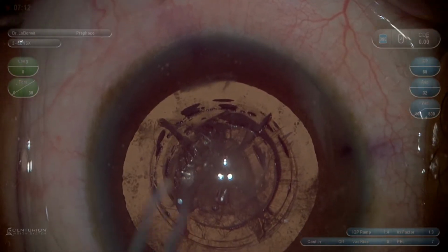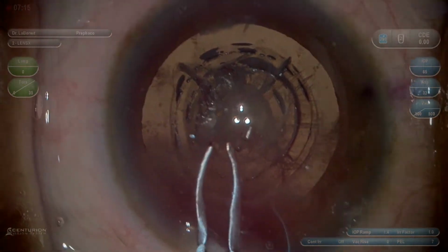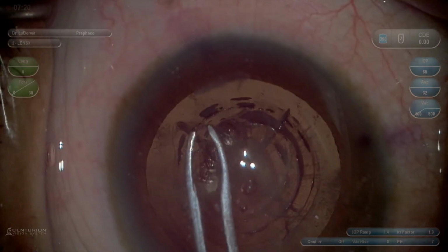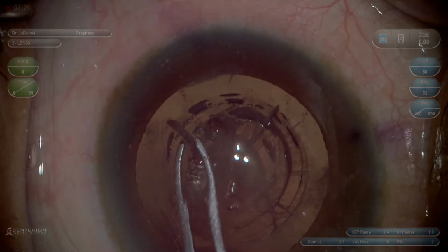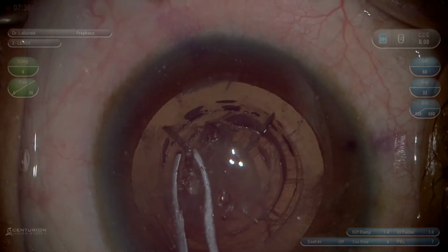Here's a zoomed in red reflex showing that the capsule is starting to tear out. I enter the eye with the Utrata. What's nice about FLACS is in these cases you can always take a step back and resort to your traditional surgical techniques. I left this unedited so you can see the struggle and how real it gets.